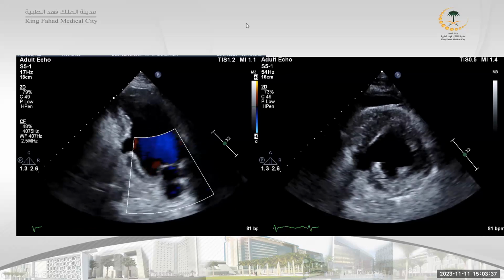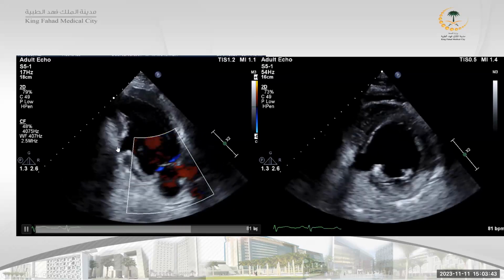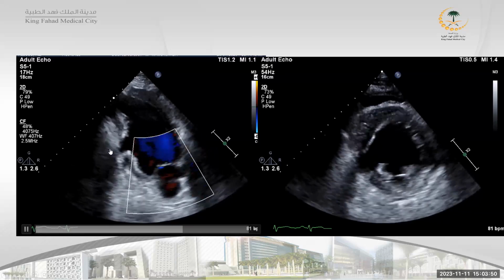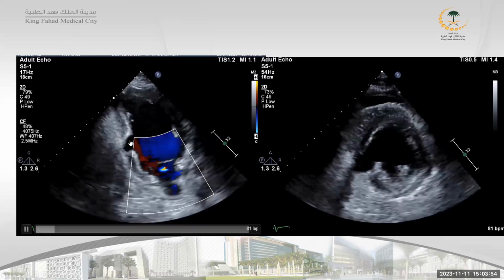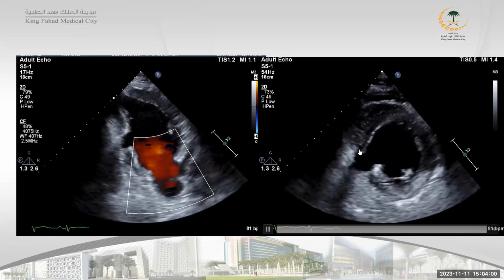Yeah, excellent. This is pseudoaneurysm of the inferior wall. This is a complication that happens after a free wall rupture, but this is called contained rupture, please. Don't tell this is free wall rupture. Free wall rupture means the patient likely will die if you have not sent him to emergency surgery. So this is likely sealed, okay? Free wall rupture, and this pericardial effusion could be the consequence of this. And this is pseudoaneurysm of the inferior wall.